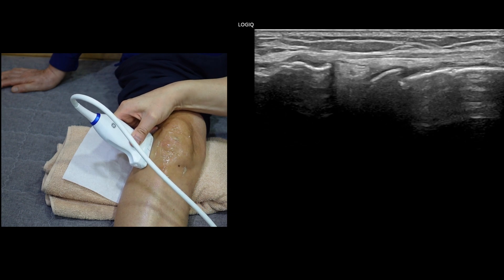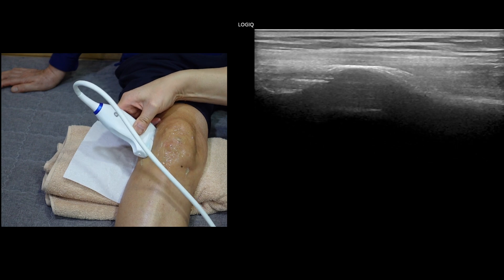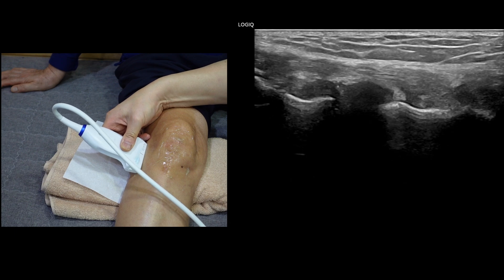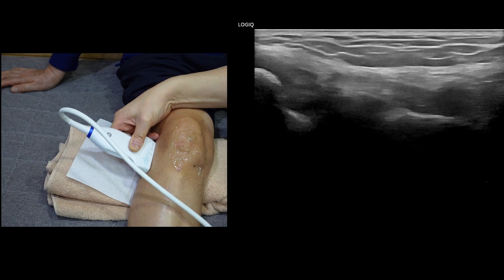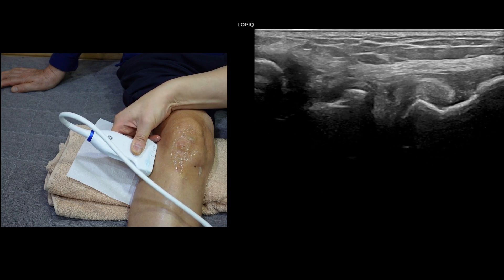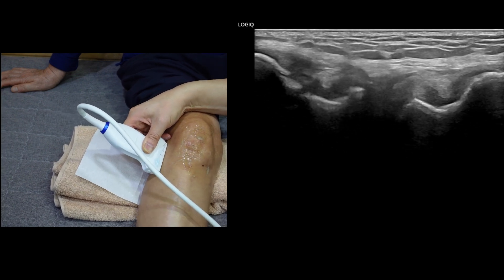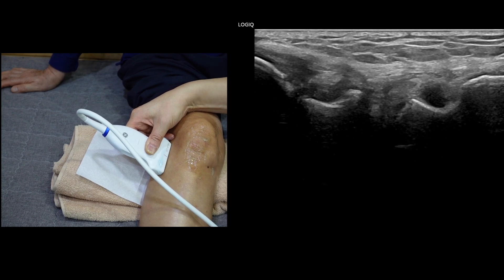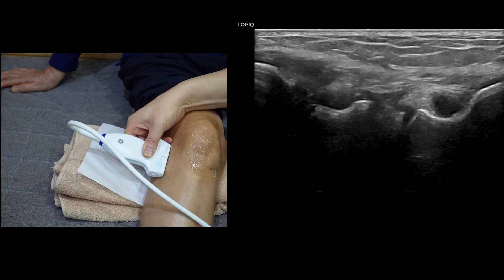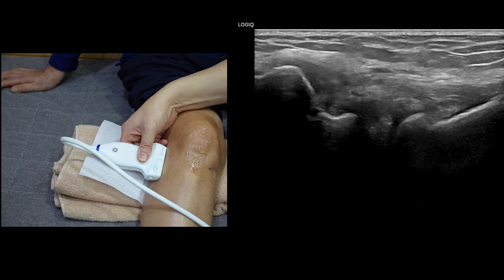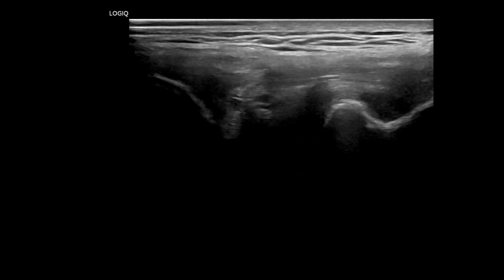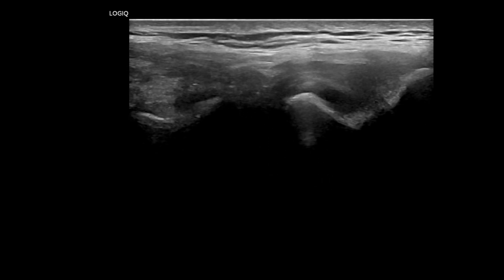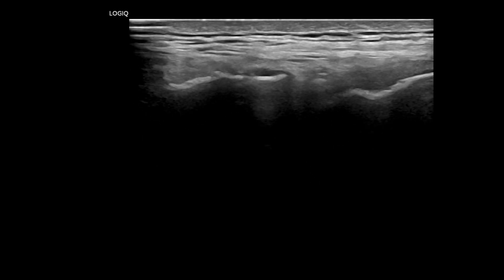Lateral evaluation. Imaging commences in the sagittal plane just lateral to the patellar tendon. Begin by checking the iliotibial band along its long axis down to Gerdy's tubercle. The iliotibial tract is visible as a thin, flat, hyperechoic fibrillar structure. Be sure to search for any soft tissue lesions immediately superficial to the base of the lateral meniscus, such as a meniscal cyst. With the knee extended, place the lower edge of the probe on the fibular head, then slide its upper edge anteriorly until the lateral collateral ligament is visualized as elongated as possible in the ultrasound image. The distal aspect of the lateral collateral ligament may appear slightly thickened and heterogeneous near the proximal fibular attachment, potentially due to the adjacent biceps femoris tendon and anisotropy.